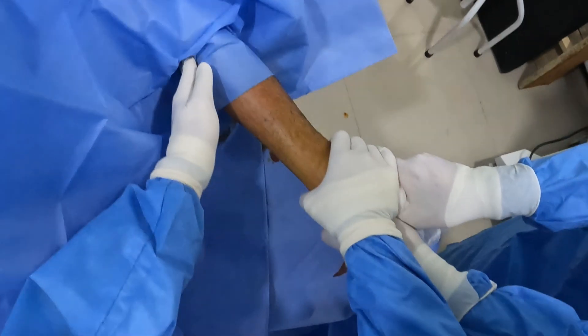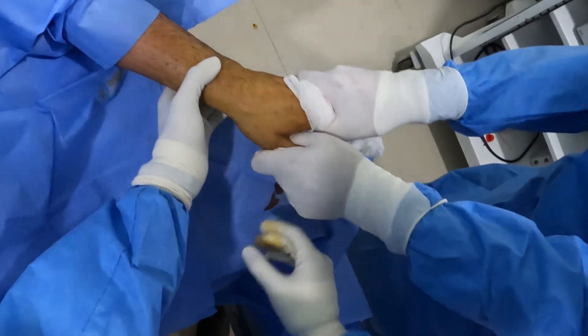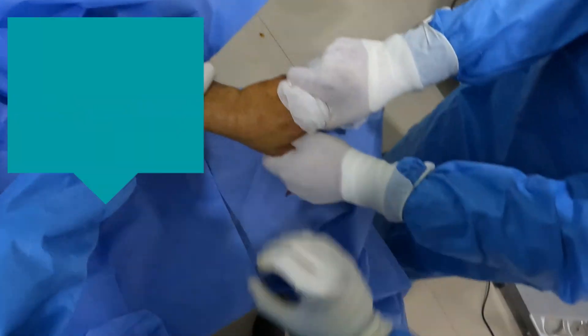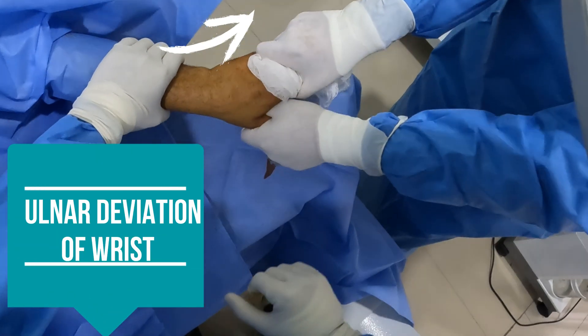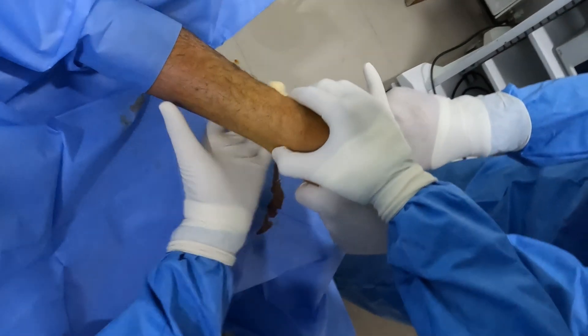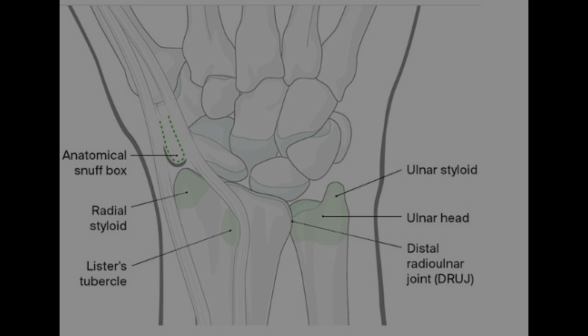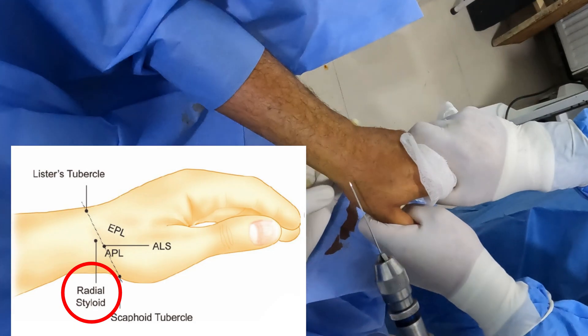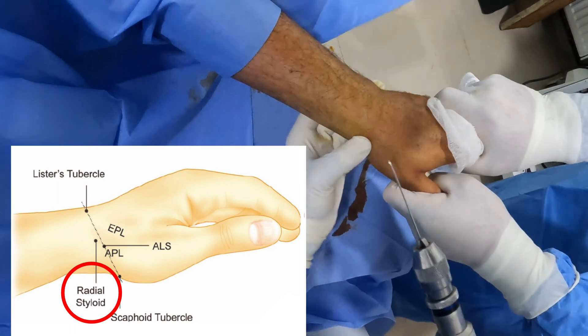My assistant holds the hand of the patient giving radial-ulnar deviation, as you can see in this video, so that I get some offset to place my wire. I'm palpating the radial styloid. This is a very important step — there are two landmarks: the radial styloid and Lister's tubercle, which are critical in order to perform closed reduction of the distal radius.